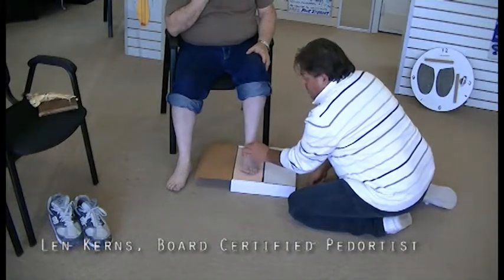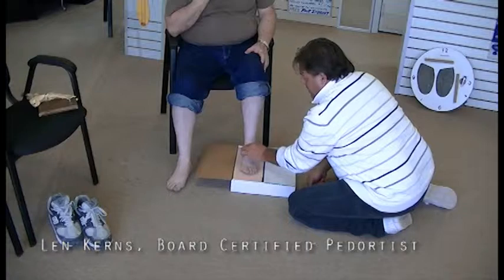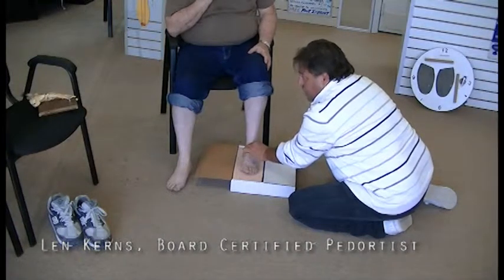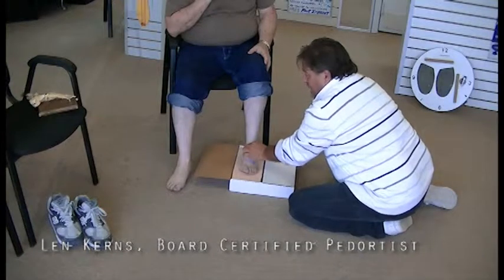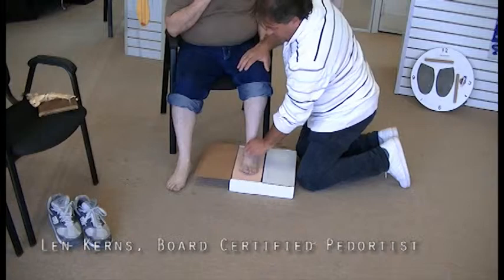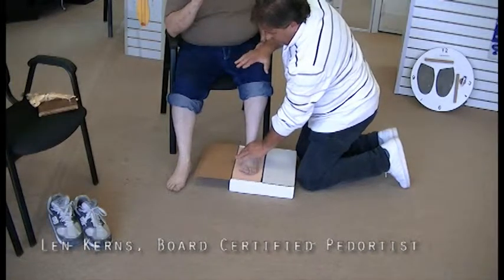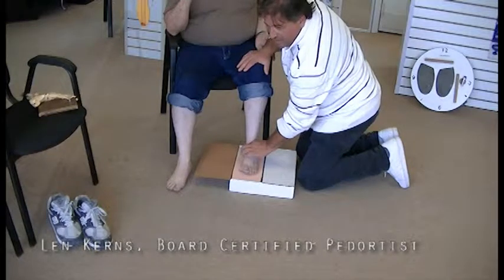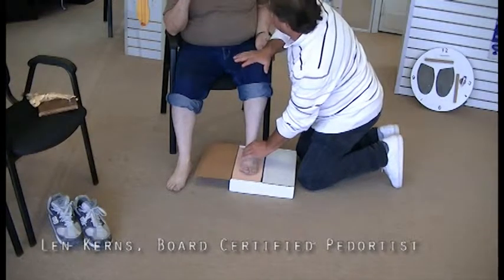The ankle and the navicular bone are really locked solid in place. We can hold this bone and this foot in position just by the rotation of the box. At this point, I come right over, perpendicular to the floor, up with my right hand on his left knee. I'm holding the talus and the navicular bone in place.